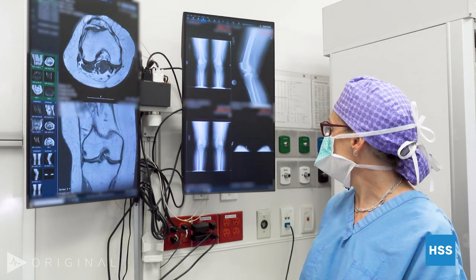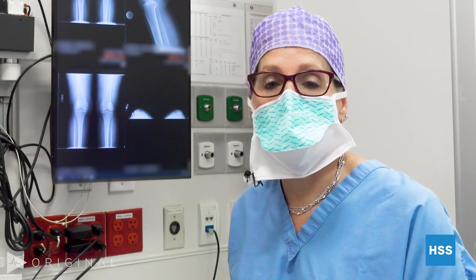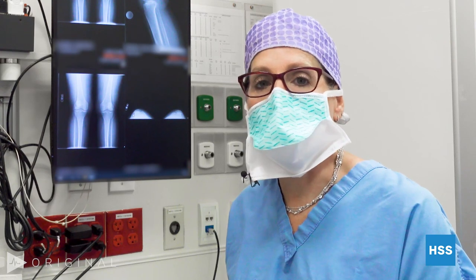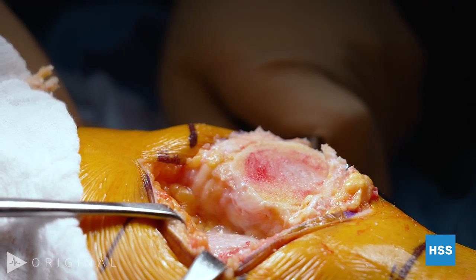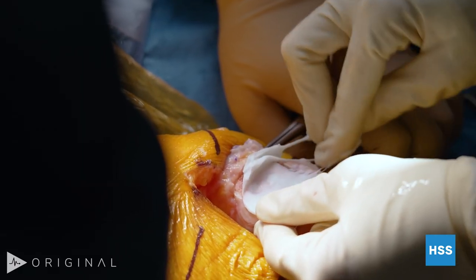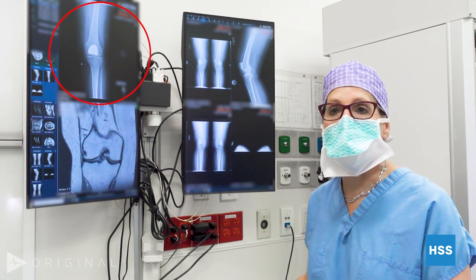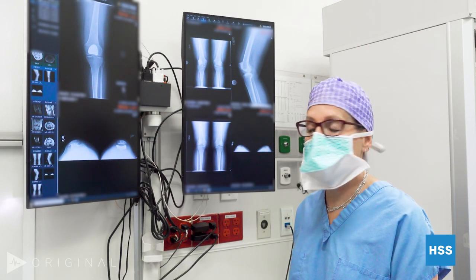In this case, because this patient has malalignment arthritis — that extra load on one side — this is a very good indication for this operation. There's a real reason why she developed arthritis in just this compartment, and she likely won't progress to the other parts of the knee quickly. This operation can last 15 to 20 years or even longer. So today we're going to resurface the patella and femur. I did her other knee six months ago — this is what the femoral covering looks like, and she now has nice space with a pretty even amount of tilt.